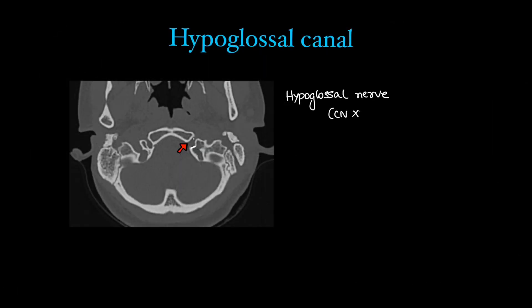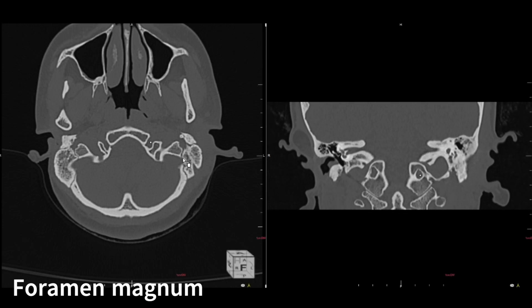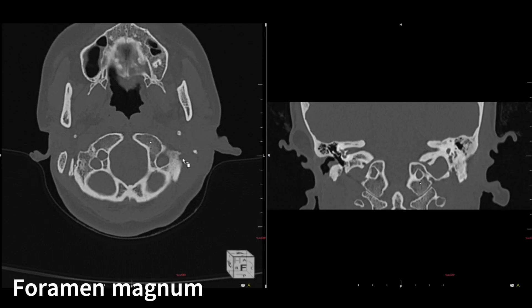Contents of the hypoglossal canal: the hypoglossal nerve, which is the last cranial nerve (CN XII), and the meningeal branch of the ascending pharyngeal artery passing through this foramen. The last foramen is the very obvious foramen magnum at the base of the skull.